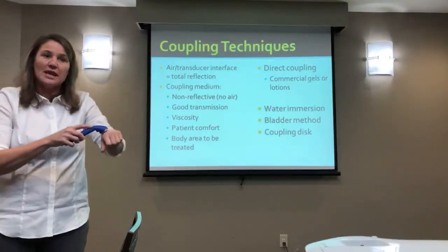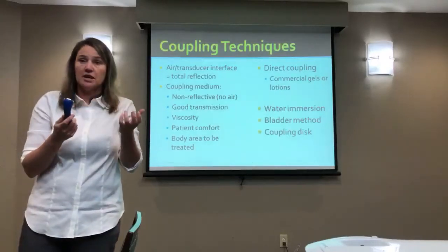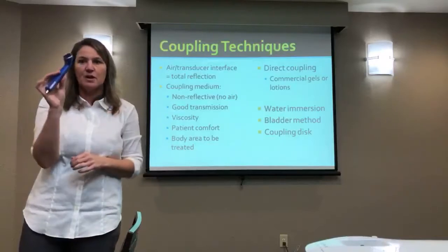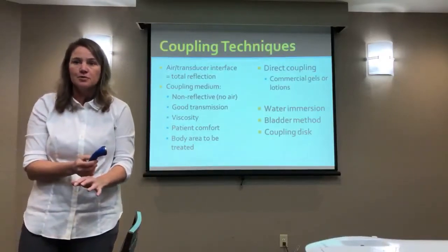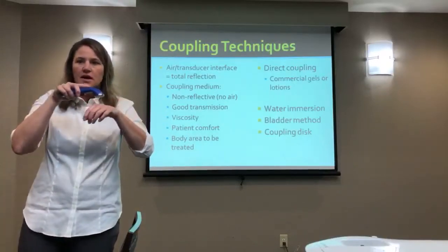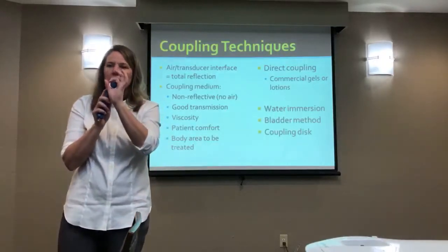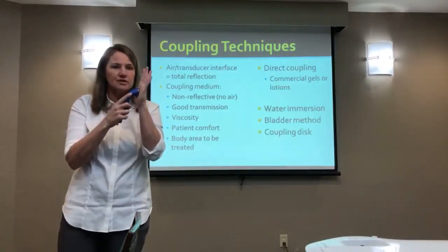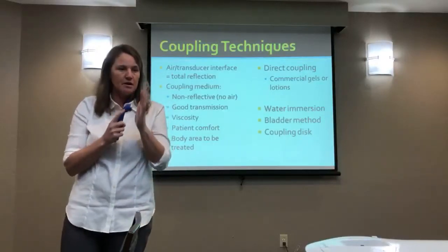Now if you're somewhere where you can't do that, then you have to think about, is there air getting in, the air pockets? So a hand or a finger, if I wanted to use something this big, a bucket really would be my best option because it's going to eliminate any air. It's going to be hard to do with gel. But you know, the smaller the area, the less similar the surfaces are, the less likely you're going to be able to get a good coupling of that tissue.